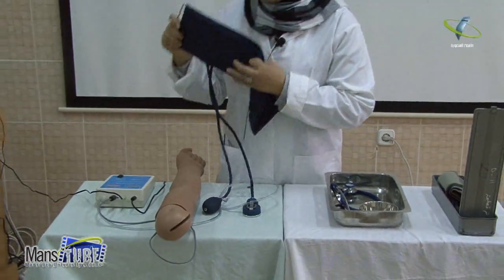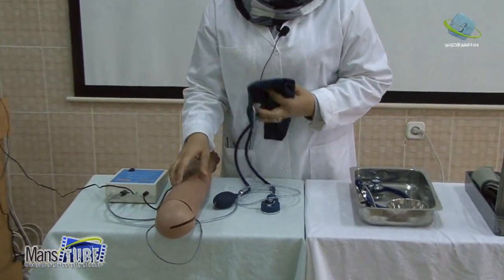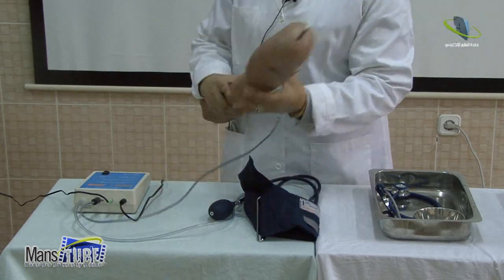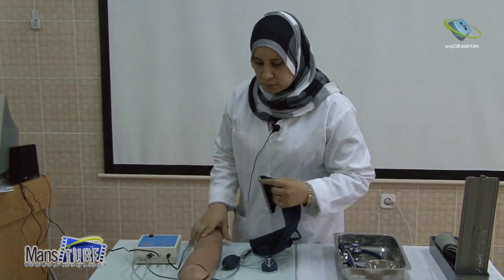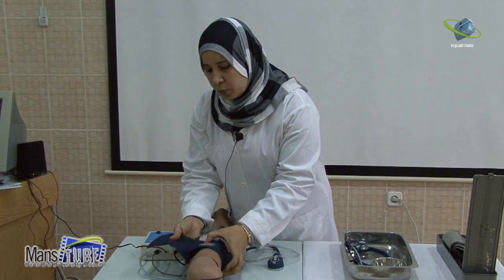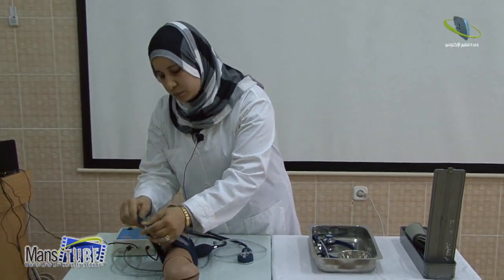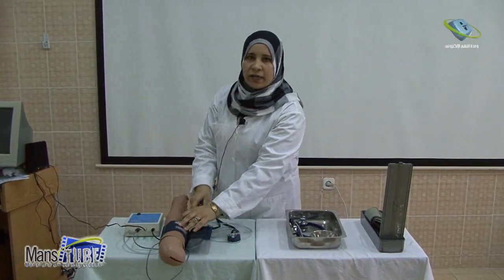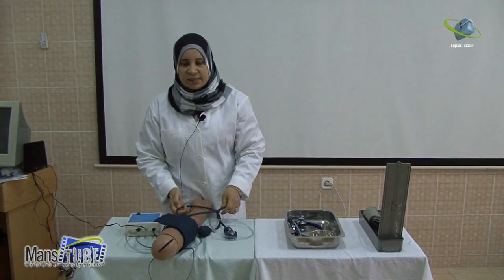Apply the cuff without closing it too tightly and fix it. It should be placed above the antecubital fossa with the bladder centered. It should be not too tight and not too loose, with the tubes along the radial and ulnar aspect.